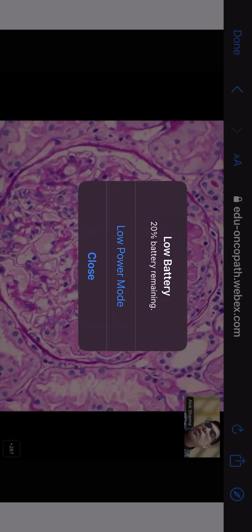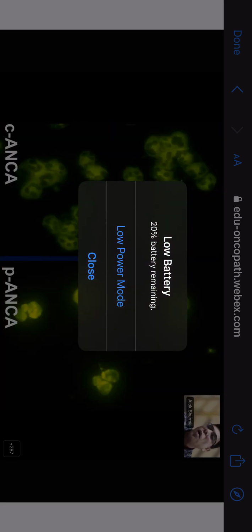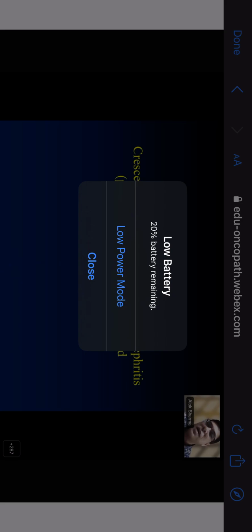On a similar note, you can have a negative IF. There we call it a pauci-immune necrotizing crescentic GN, of which the ANCA associated GN is the most common. ANCAs are anti-neutrophilic cytoplasmic antibodies, as you must be knowing. They can be perinuclear or cytoplasmic, and these also induce a similar picture of necrotizing and crescentic GN. So if you have a necrotizing crescentic GN, most of the time you will either have an IF negative, or an IF showing linear IgG. In the linear case, you need to investigate for anti-GBM antibodies. If it is IF negative, you need to investigate for ANCA antibody, right?